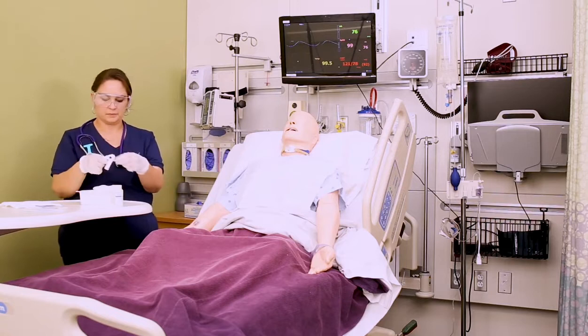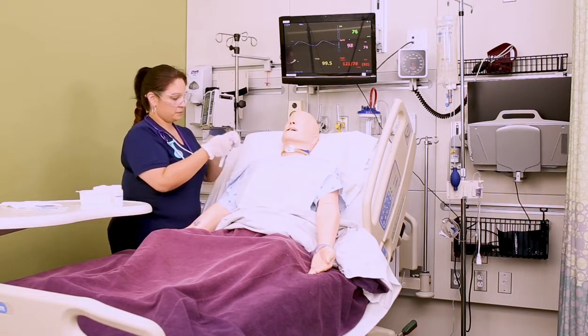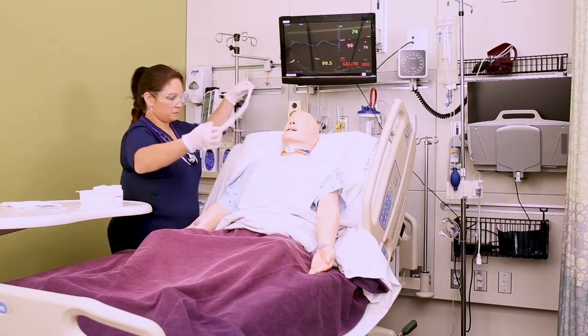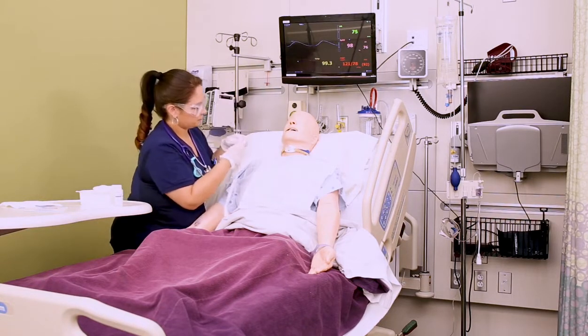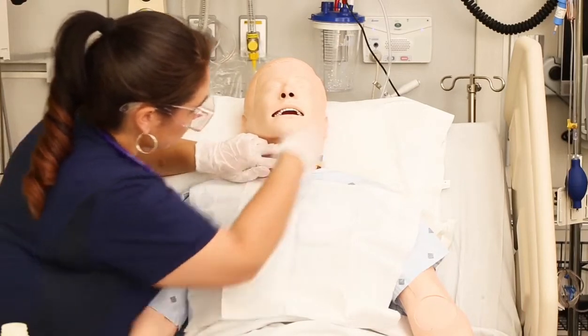Now, if you don't have a disposable and you need to clean your inner cannula, use the brush in the kit and the saline solution. Notice we don't use hydrogen peroxide unless there's an obvious skin infection. It prevents healing. So now it's time to change the trach ties.